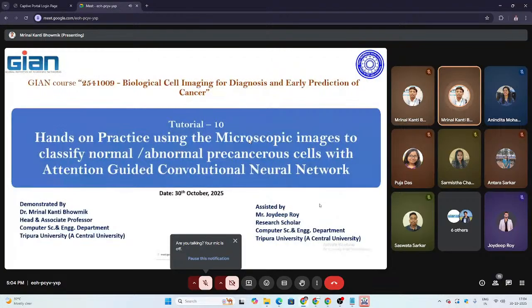Thank you, sir, for giving me this opportunity to present today's tutorial, hands-on practice using microscopic images to classify normal or abnormal precancerous cells with an attention-guided convolutional neural network. Good evening, everyone.